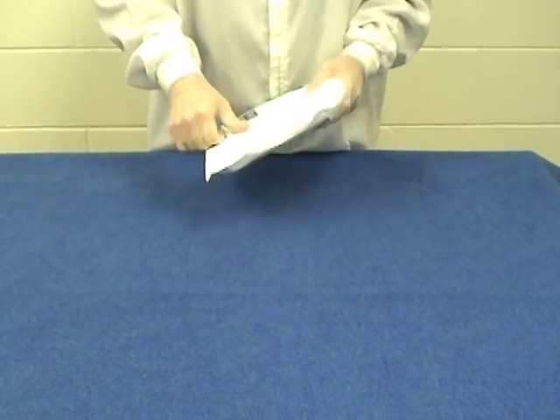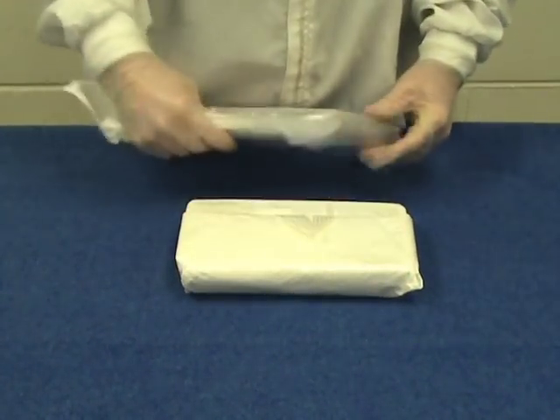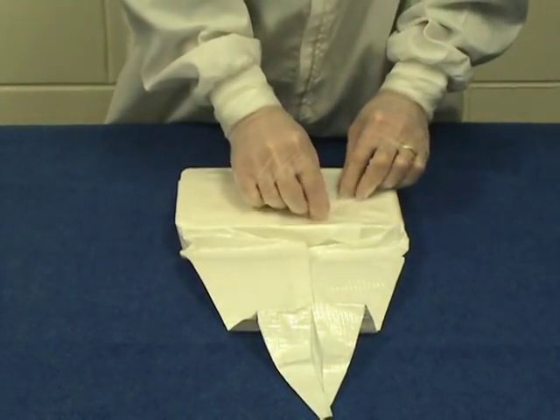The thoracic vent comes in a procedure tray that is conveniently packaged in a sterile pouch. The pouch can be opened by peeling back the Tyvek strip. A sterile field is obtained by unfolding the CSR wrap.